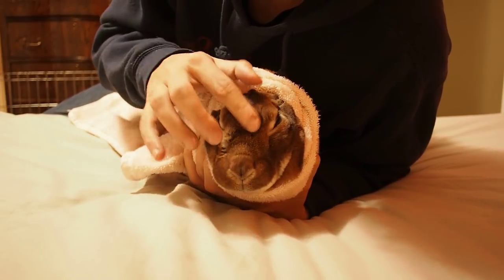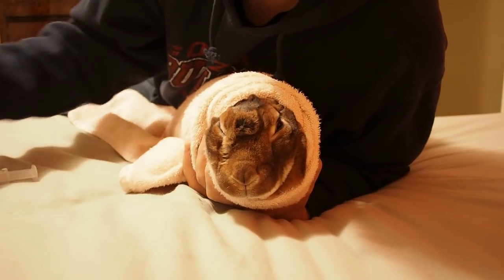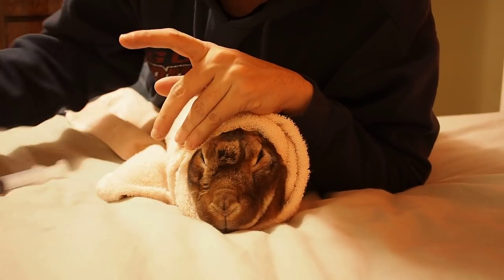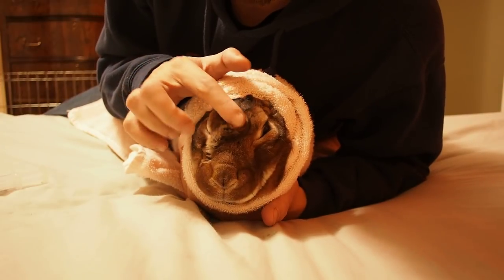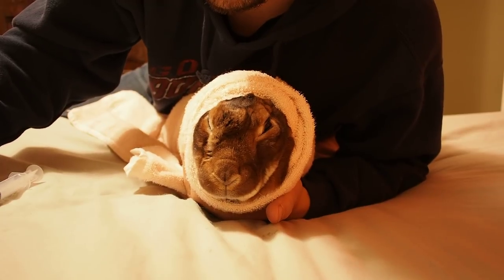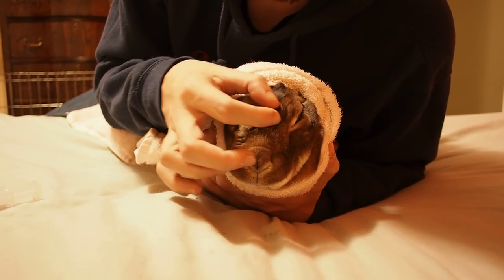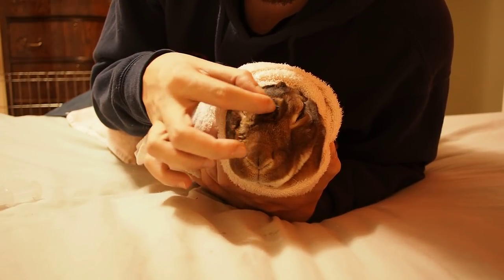She knows it's coming — she knows this is going to be a little painful. So I tend to just flush a teeny little bit out first, like that. Put the needle back up on the bed. Make sure when you put it down it doesn't poke into the bed — you don't want to dull the bevel before poking. Everything looks good. I've already washed my hands about five times before this.